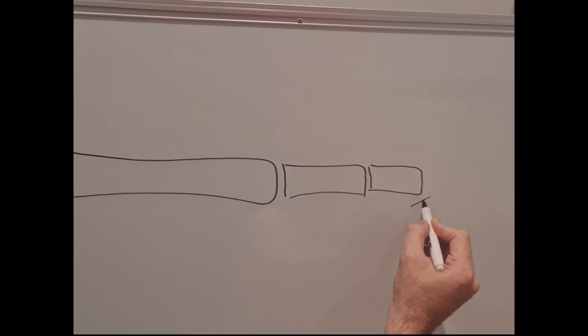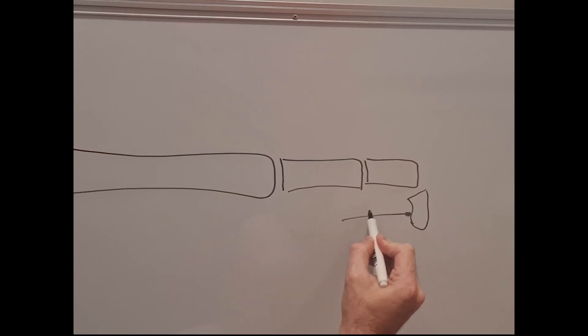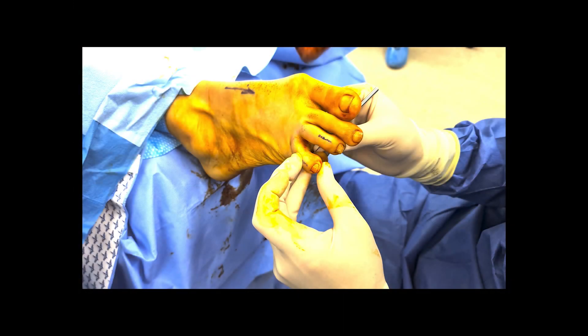The long flexor tendons attached to the ends of the toes are pulling the distal interphalangeal joints into this position. The first part of the surgical procedure involves releasing this tendon. This is done through a small incision under the toe approximately one millimeter in length. Here I used a 61 blade to achieve this percutaneous release.